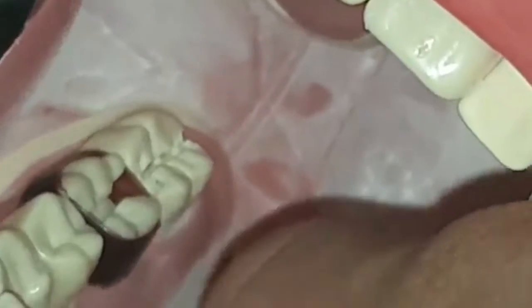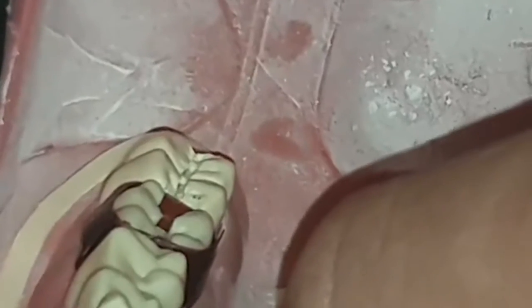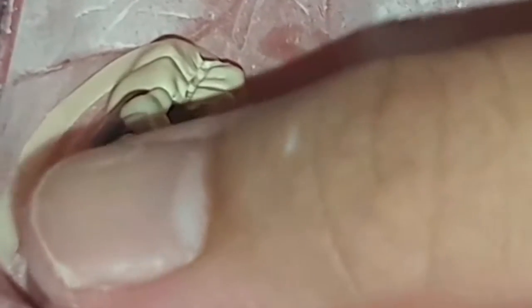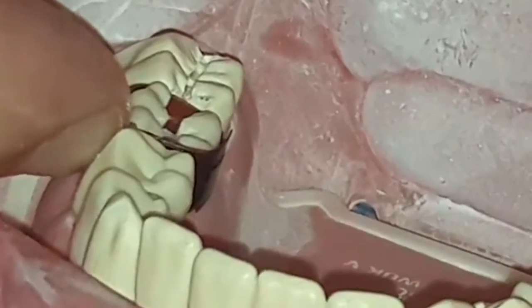I hope I will not hit the adjacent tooth this time. I'm using a very sensitive strip of sticker to ensure whether I'm touching the adjacent molar or not.